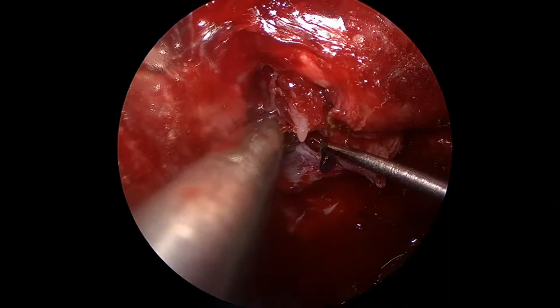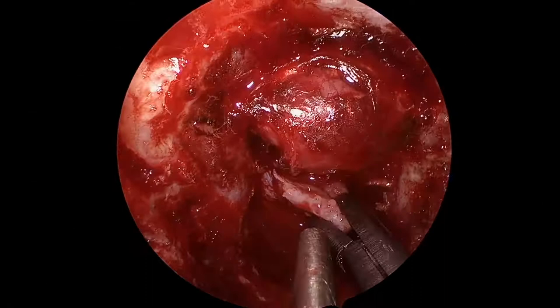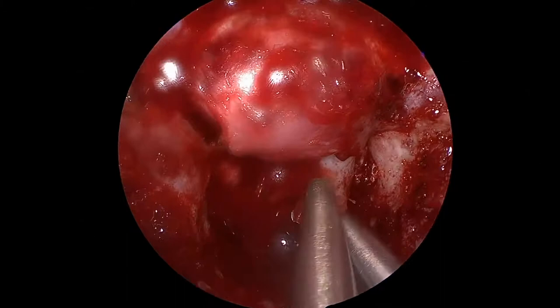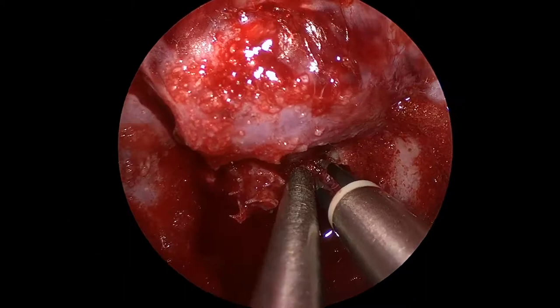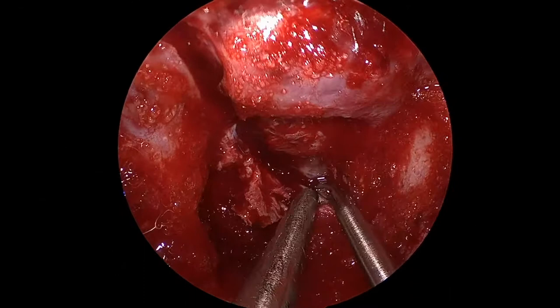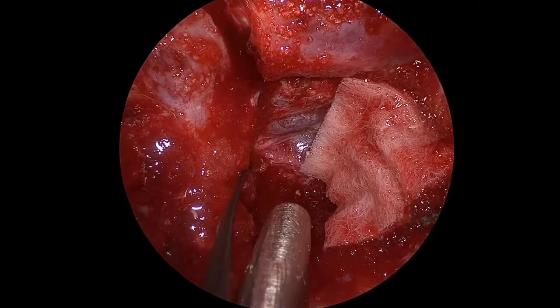This is going to allow me to use the dissector to gently remove the posterior clinoid. We can see its posterolateral extension, and I can now remove the posterior clinoid completely and the dorsum sella. Now we're removing the posterior clinoid on the left side of the patient. In this case, since I have more space, I can do it in an extradural fashion, but I still get venous bleeding from the cavernous sinus, which is easily controlled. Finally, removing the dorsum sella and posterior clinoid allows me to remove all the tumor that is invading the interdural space, and this outer layer of dura is going to be extensively removed.